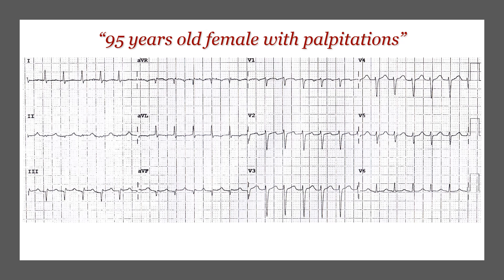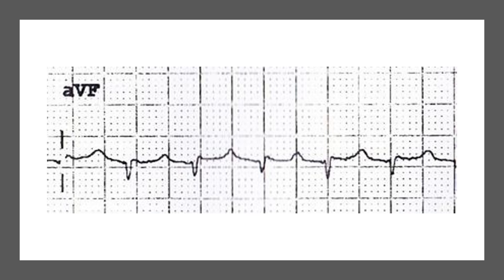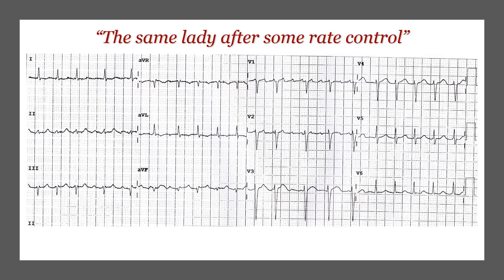Here is another example of the Bix rule from our Facebook page. This was a 95-year-old lady who presented with palpitations. It was difficult to say whether this was atrial flutter or SVT — just a narrow complex regular tachycardia. But if you look carefully, there is what looks like a P wave just in the middle between two complexes. According to the Bix rule, there may be hidden P waves in the complexes before and after. After rate controlling this lady, we could clearly see the flutter waves — confirming this was also atrial flutter.